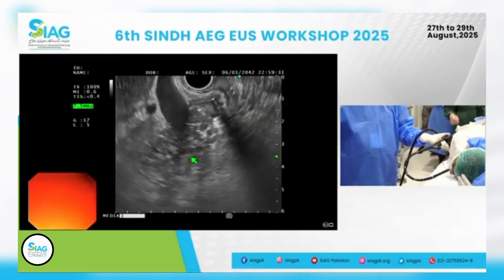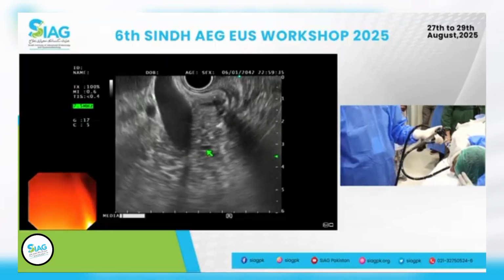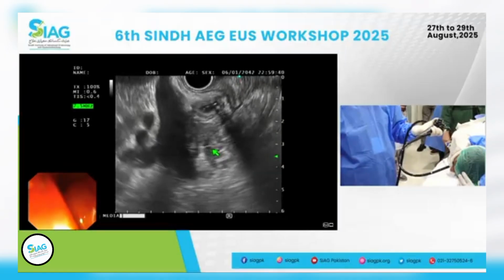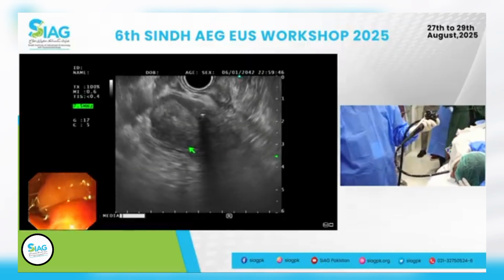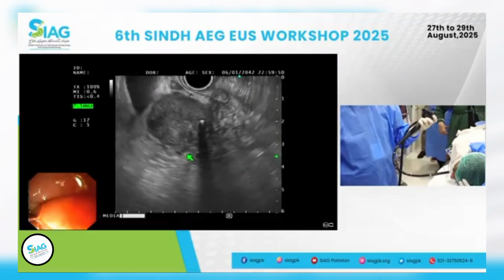But look at my hand, right hand is free. So right here, pancreatic duct, now following towards the head of the pancreas, going there. Now because of the mass, it's compressed, but it's right underneath, rotating the scope, trying to do everything with the left hand.